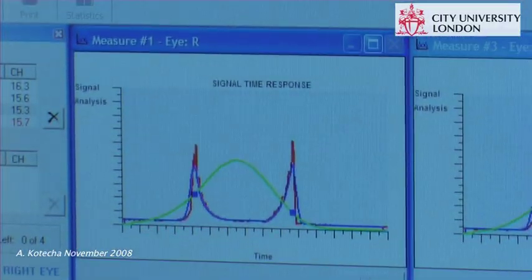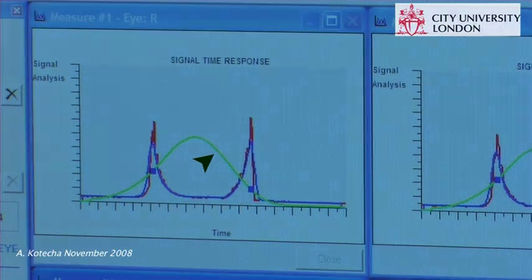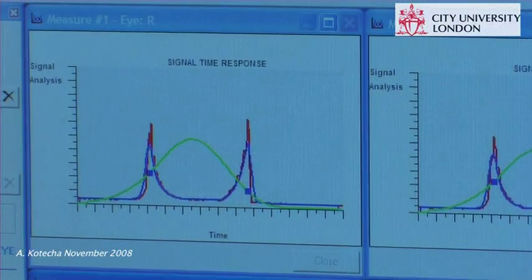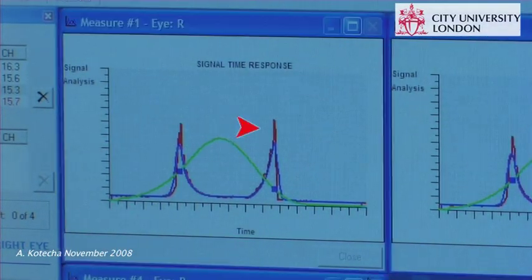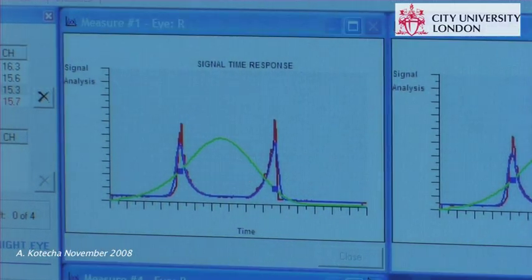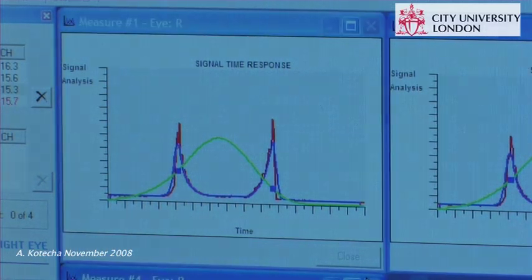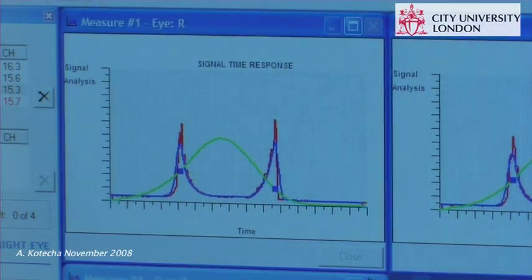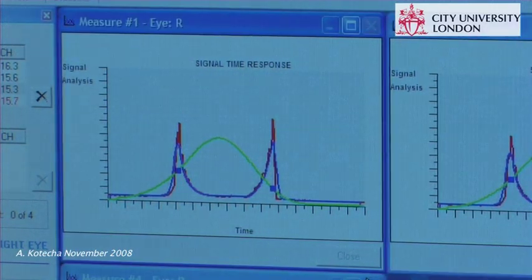The green line represents the air pressure increasing and then reducing, and the red-blue lines show the applanation events as the air pressure rises and then falls. The second applanation event occurs at a lower air pressure compared with the first, and this has been attributed to the cornea's viscoelasticity. The cornea is acting like a shock absorber, absorbing and then dissipating the force of the air pressure applied. This corneal property has been termed corneal hysteresis.